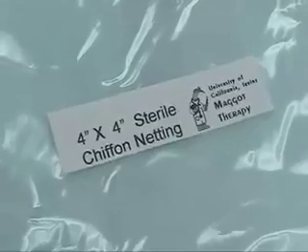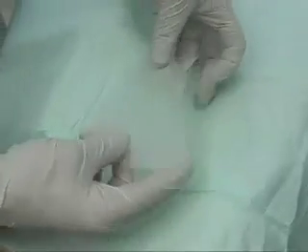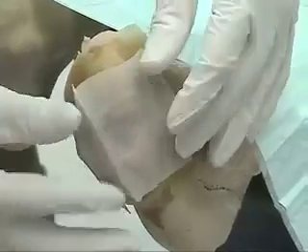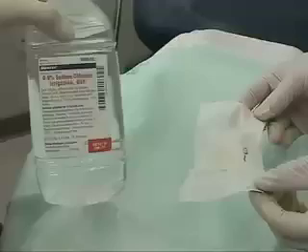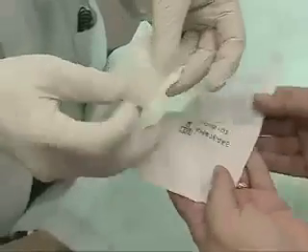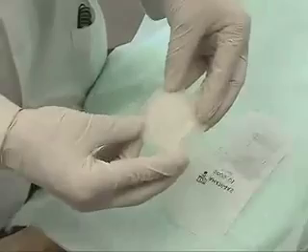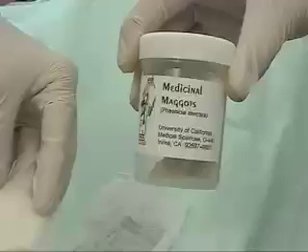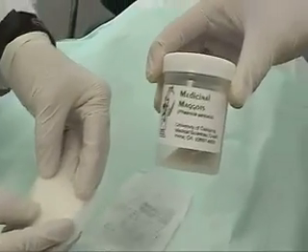Our next step is to apply a sterile nylon chiffon mesh, which you see here. This is also known as wound contact layer. This can then be applied within the boundaries of the hydrocolloid dressing, and this forms the intimate layer where the larvae will live. This can then be applied over some moist 2x2s or 4x4s, and now we are ready to apply the maggots to that construct.